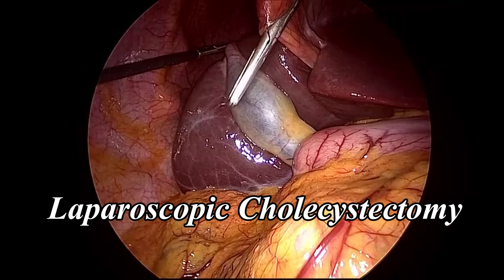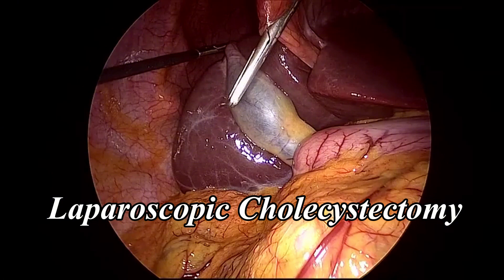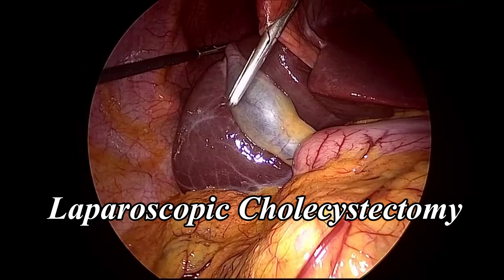Step 5: Gallbladder Removal. With the duct and artery divided, the gallbladder is dissected from the liver bed using hook cautery, spatula, or energy devices like the harmonic scalpel. Bleeding is controlled with electrocautery or hemostatic agents. The gallbladder is removed through the umbilical port, often inside a specimen retrieval bag to avoid contamination. If the gallbladder is distended, it may be decompressed with suction before removal.